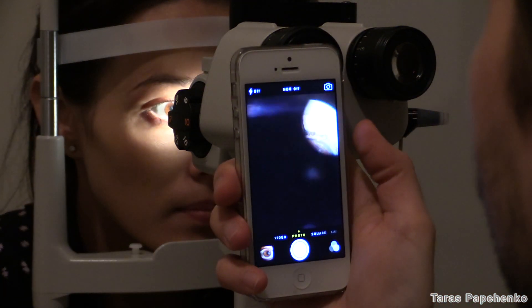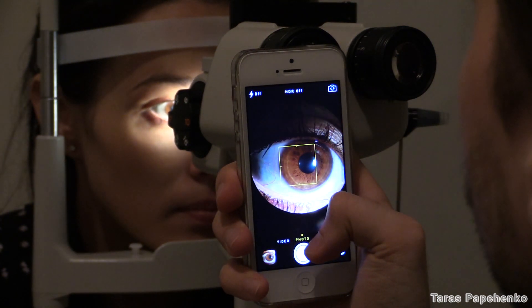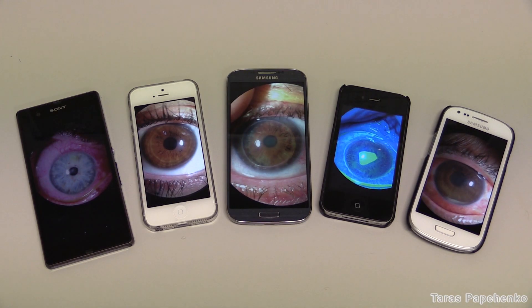Bring the phone close to the eyepiece and slowly pull back until you get an image. Take your time adjusting the image. Now take a picture with your thumb and you're done. Any smartphone can be used to take this kind of photos.